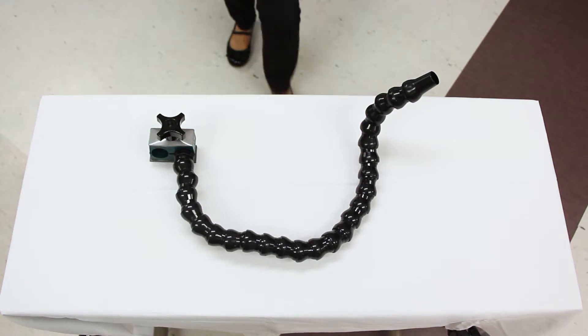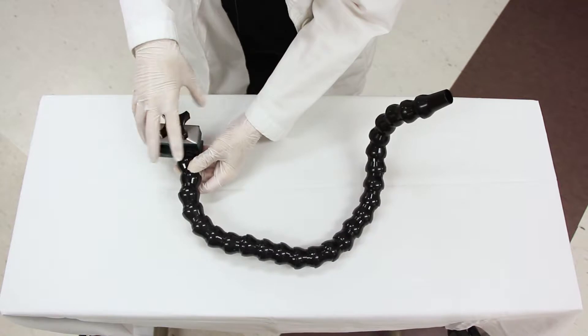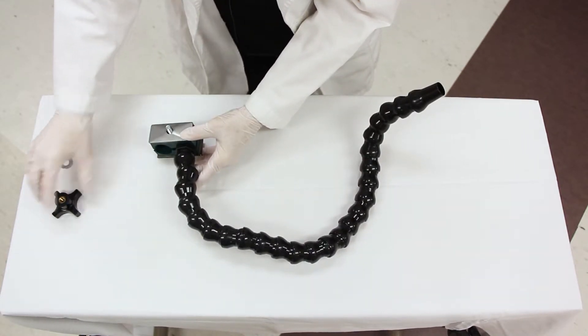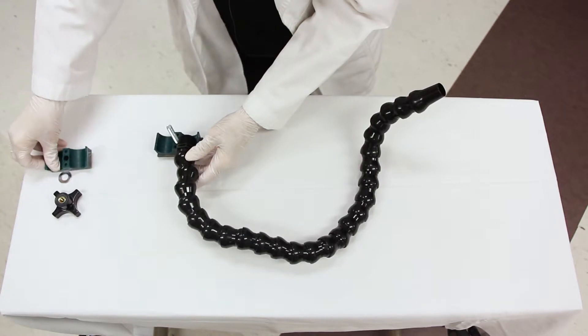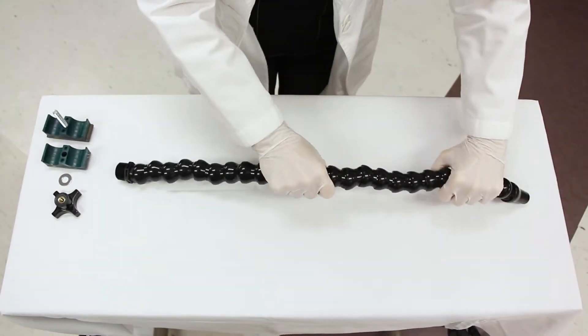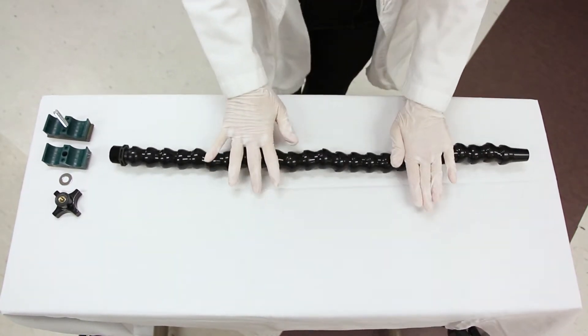To assemble the flexible arm and circuit, first remove the CanVent arm clamp. Straighten the arm by using the palms of your hands to roll the arm on a flat surface until it is straight.